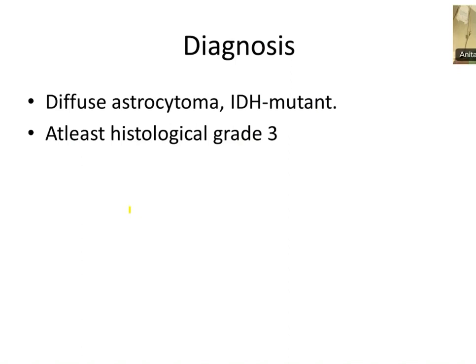What is the most important utility marker here, the molecular marker? IDH and ATRX. These are the two markers you can use as molecular markers for dividing astrocytomas, oligodendroglioma, and glioblastoma in adult type diffuse glioma. If you want to sum it up for adult diffuse gliomas, what is the most important immunohistochemistry marker? IDH and ATRX. You can have P53 also as an adjunct, but the most important are IDH and ATRX.